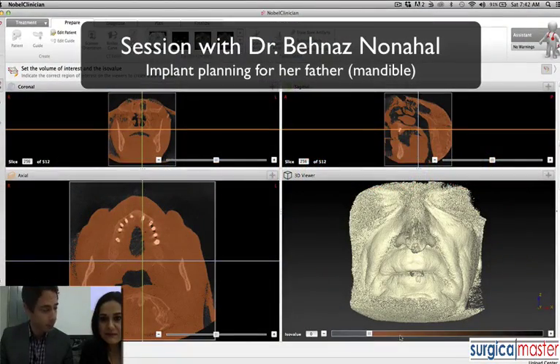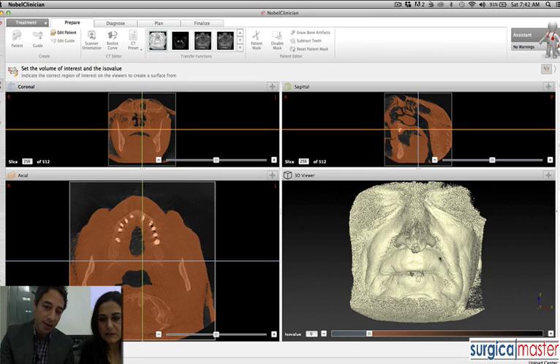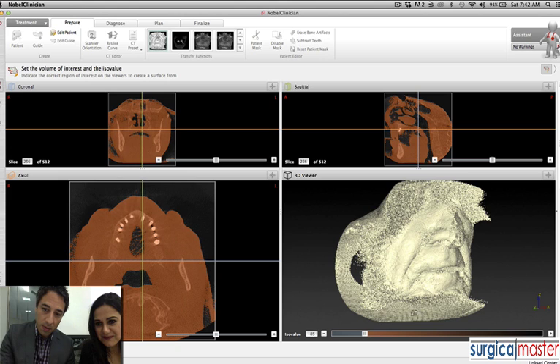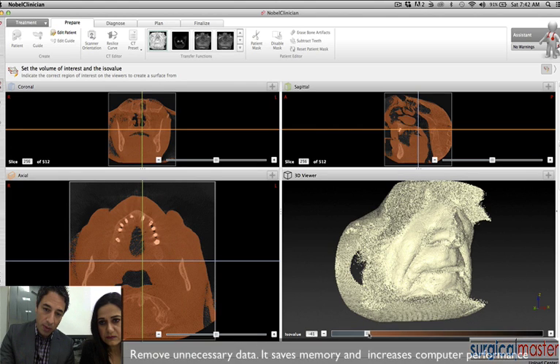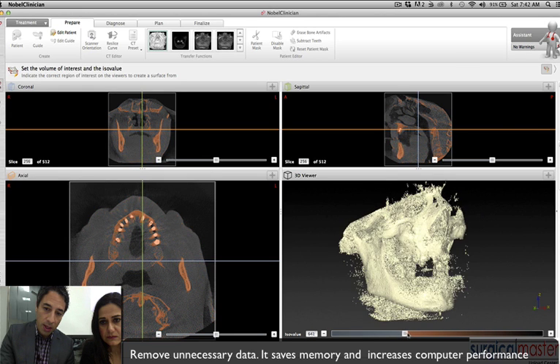Dr. Benaz, we're here with your dad's scan. I imported the DICOM data into the software — it's called Nobel Clinician. You can see a lot of detail that we don't need at the moment; you can see your dad's features. You can see he had his eyes closed and was holding a little jig between his teeth. We don't need this data, so we'll adjust the rendering — the ISO value — until we see only the actual jaw.